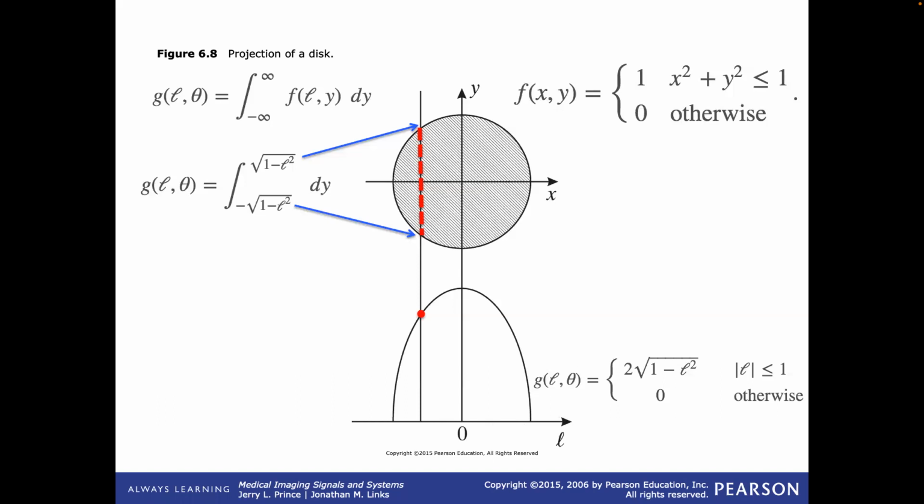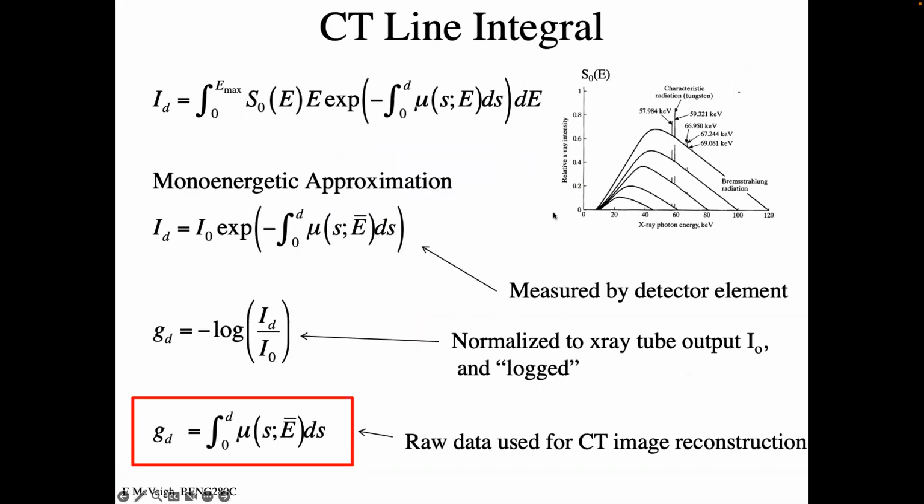So it's often used in X-ray or CT simulations, this set of objects that are analytical. And of course, if you just have a really good picture that you got before, you can just project things through it and calculate what the raw data would look like. That's another way of doing the simulation.